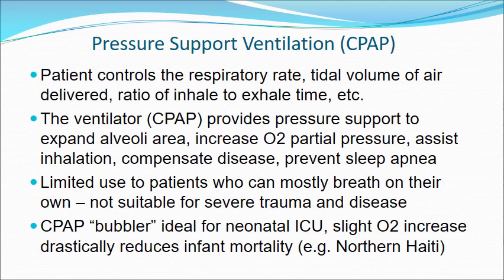Pressure support ventilation, such as CPAP: the patient controls the respiratory rate, the tidal volume of air delivered with each breath, the ratio of inhale to exhale time, and virtually everything else. The ventilator only provides pressure support to expand the alveoli area in which oxygen diffusion takes place, increase O2 partial pressure, assist inhalation, compensate disease, and prevent sleep apnea. It's limited to use on patients who can mostly breathe on their own and is not suitable for severe trauma and disease.